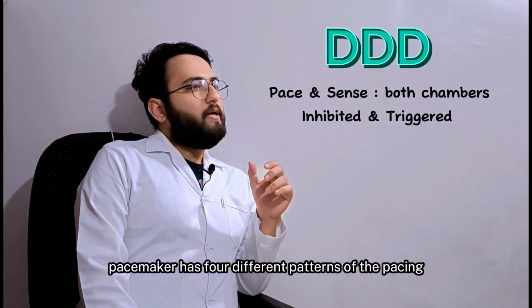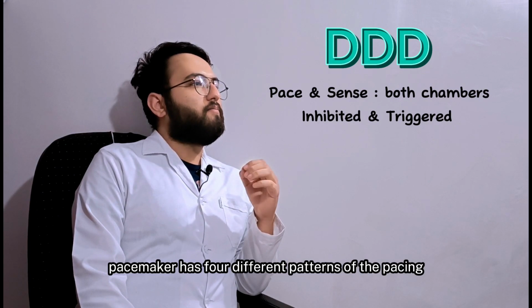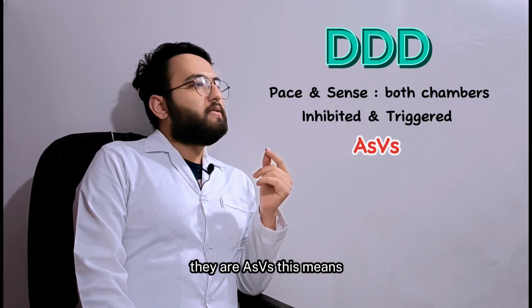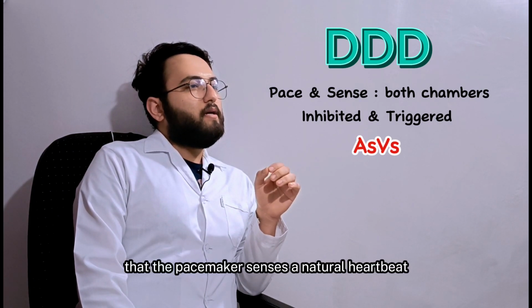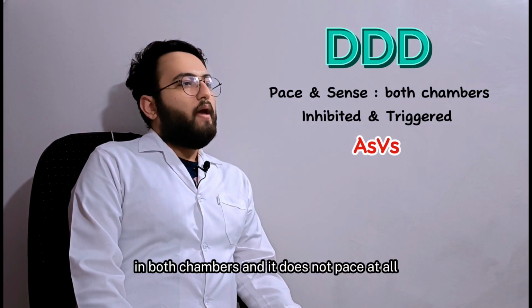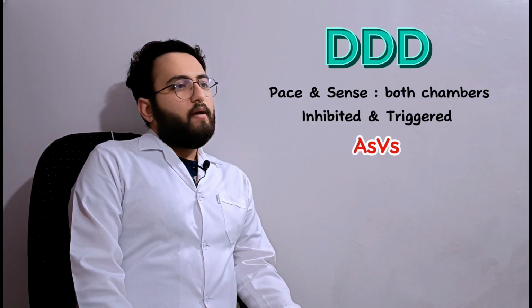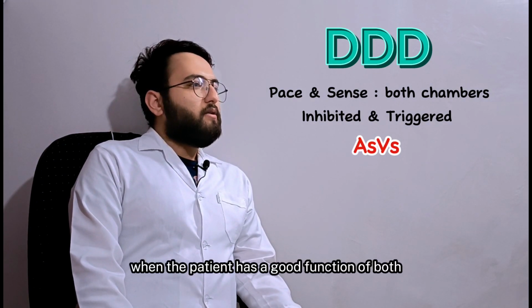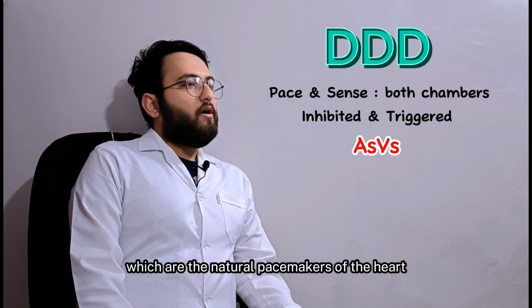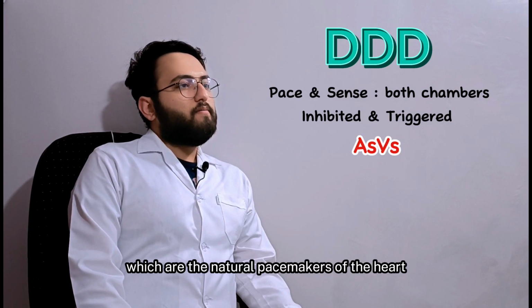The DDD pacemaker has 4 different patterns of pacing, depending on the situation. They are ASVS. This means that the pacemaker senses a natural heartbeat in both chambers, and it does not pace at all. This is used when the patient has a good function of both the sinus node and the AV node, which are the natural pacemakers of the heart.